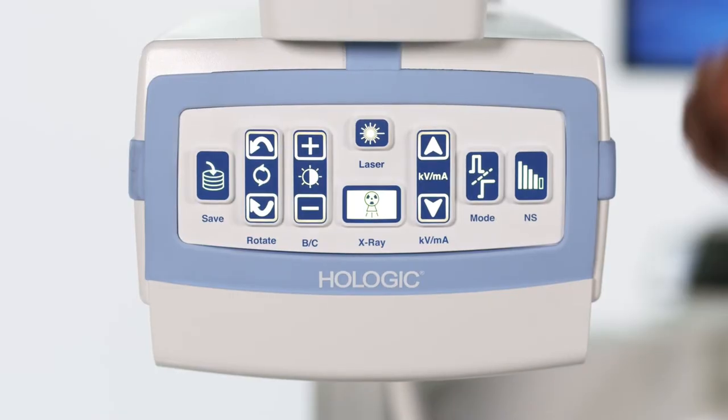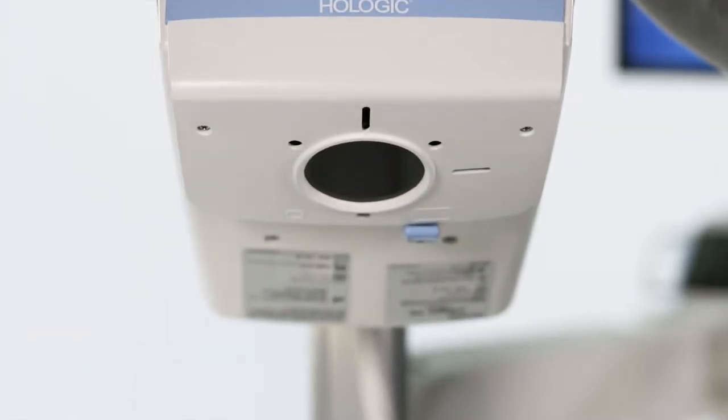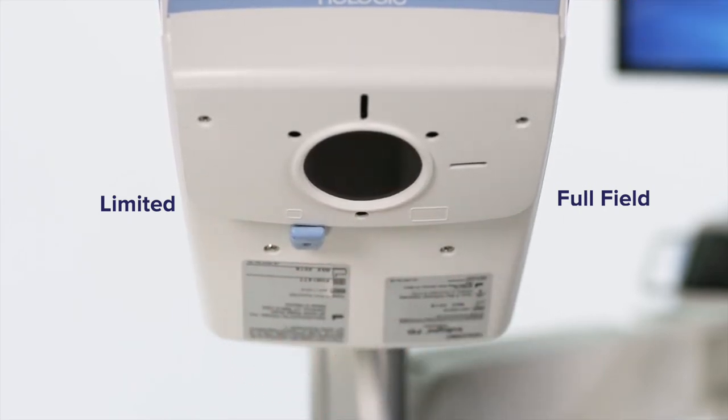Flip the C-Arm to locate the collimator. Slide the collimator over to switch between full field and limited field. Limited field is used to magnify a smaller area.